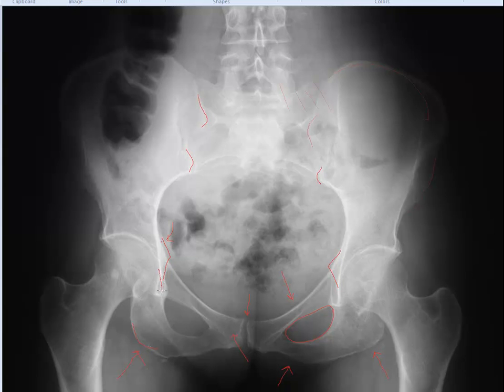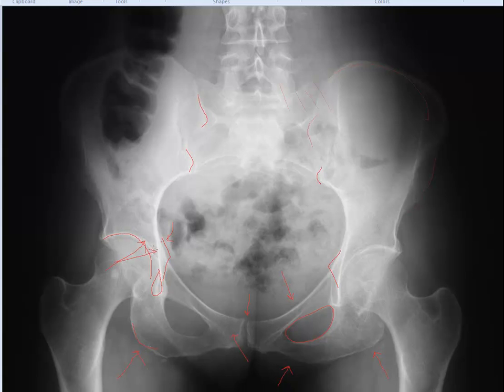Kohler's teardrop — here is Kohler's teardrop. Sometimes you see it written as teardrop of Kohler, and this region is the medial most portion of the acetabulum. Kohler's teardrop is important because if the femur axially migrates, the femoral head will begin to push or protrude the acetabulum through the pelvic floor, and you will lose Kohler's teardrop. This axial migration can happen with bone softening conditions such as Paget's disease, osteomalacia, or rickets, but also with inflammatory arthritis such as rheumatoid arthritis. If you do not see Kohler's teardrop, that is problematic and needs to be investigated.